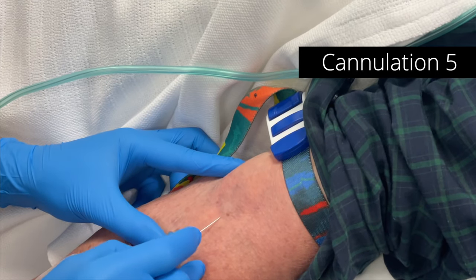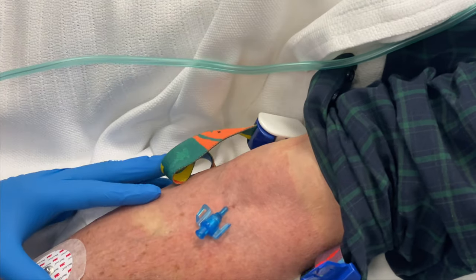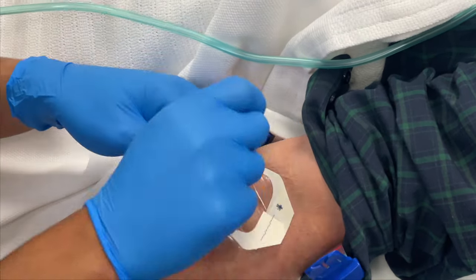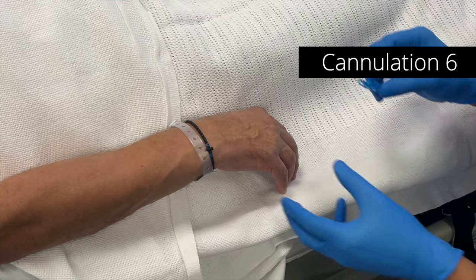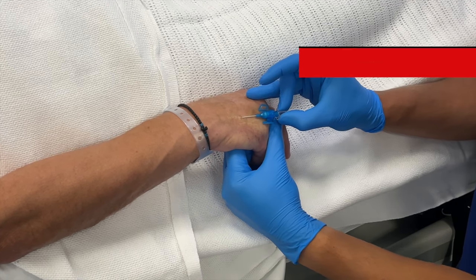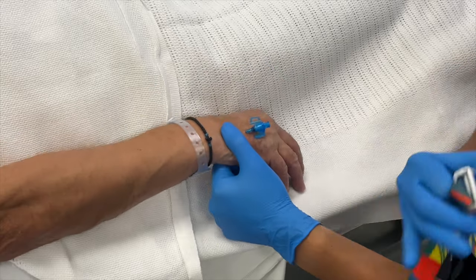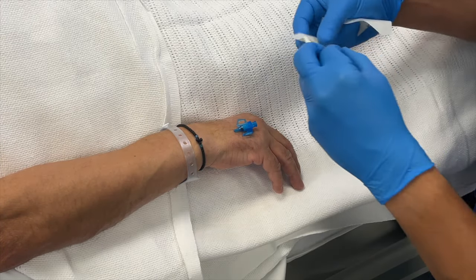Here's a cubital fossa vein — I can barely see it but I can feel it, so that's one I had to palpate rather than see. I'm being really careful in that cubital fossa region because there are tendons, nerves, and the brachial artery in that position, so my depth of insertion is always very narrow. This next cannulation is a big visible vein — I've gone at a low angle and it's very superficial. I accidentally put my thumb to prevent backflow, but these cannulas already have a bung inbuilt, so they don't have backflow.